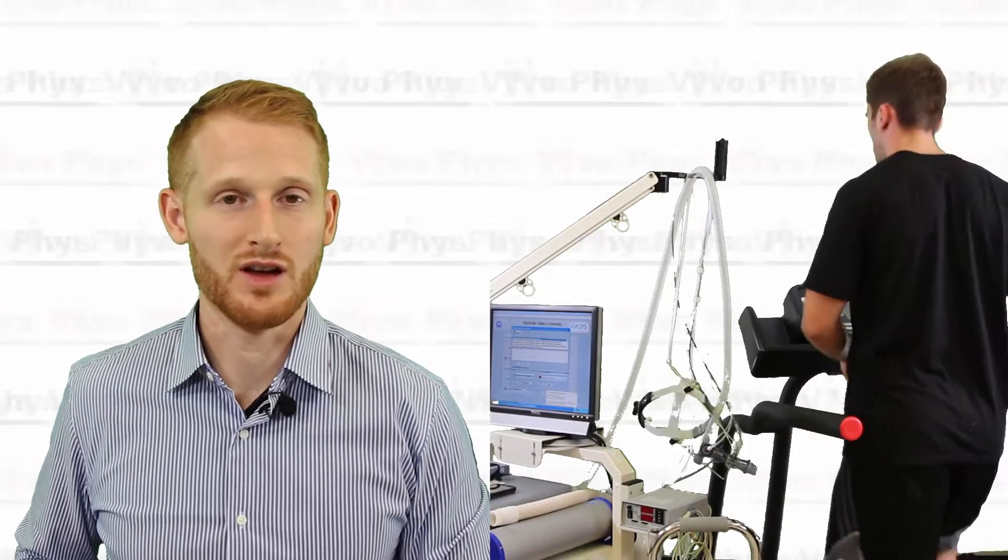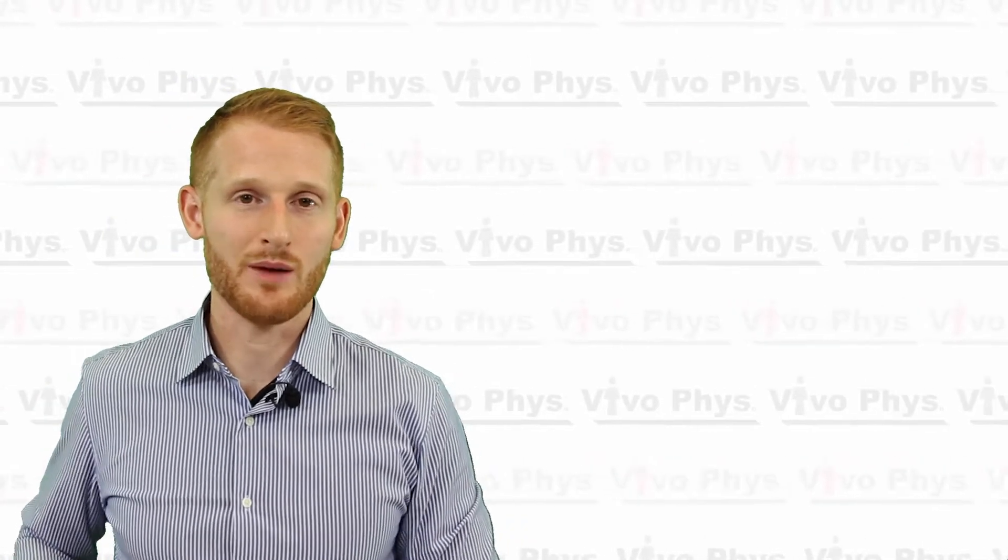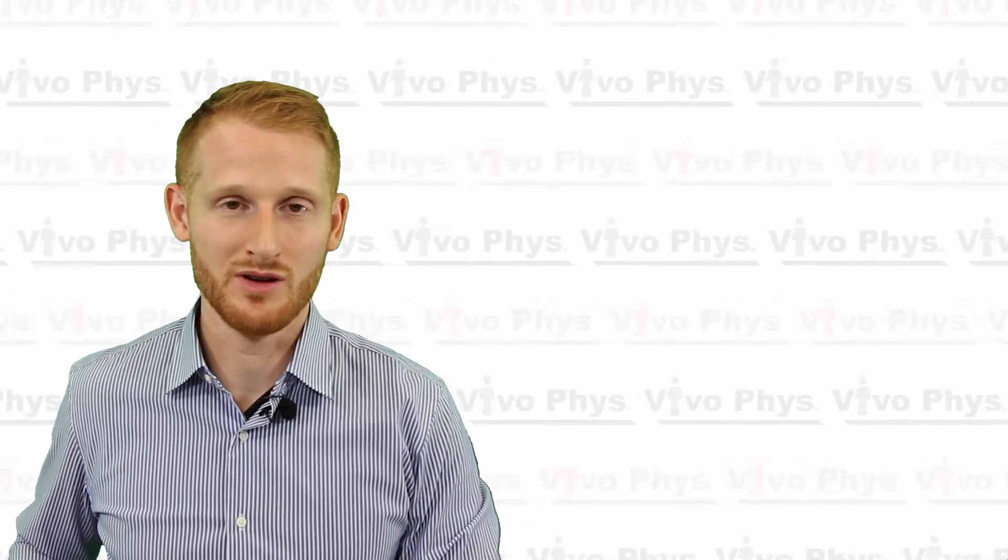Once they are ready and you've confirmed that any of the measurements you've been doing throughout the test—like heart rate, blood pressure, if you're doing ECG—make sure all those return to near baseline levels. Then you can stop them and get them off the treadmill and have them sit down and watch them for a little while to make sure that they're okay.